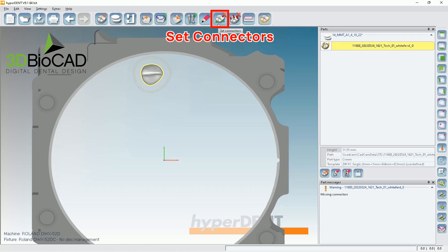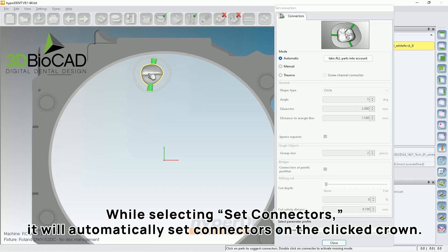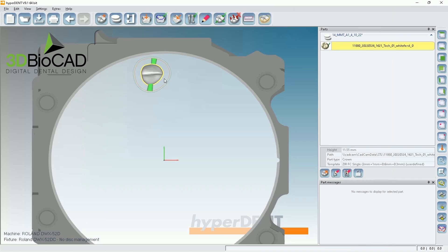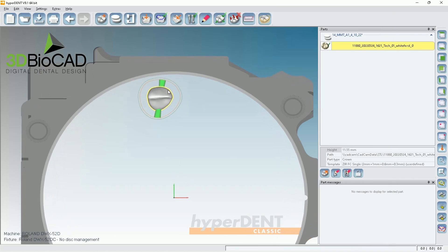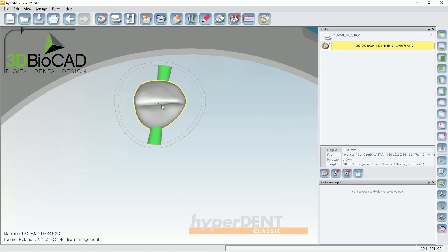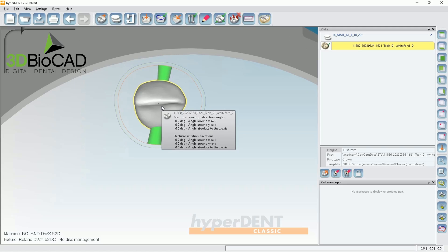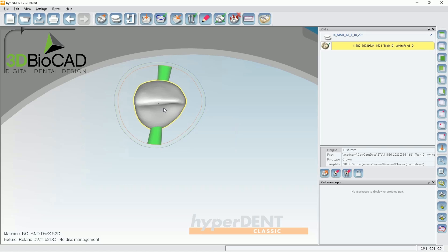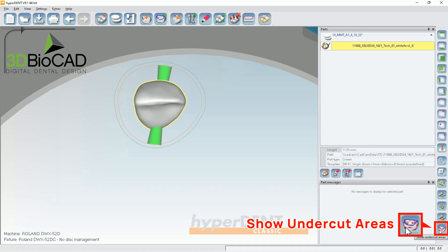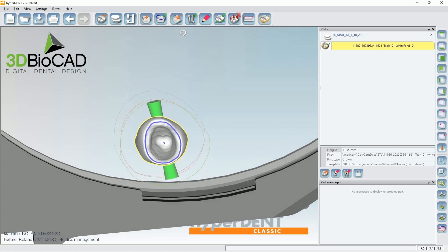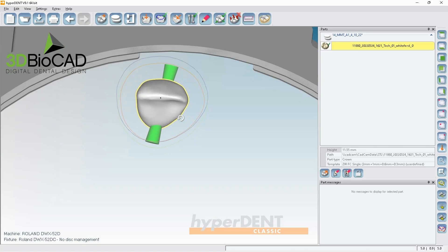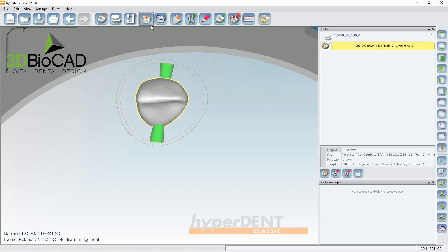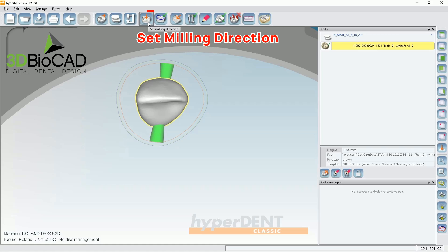And go to connector. Set connectors. And click on it. Then the software will try to add sprue or connectors on the best area where it thinks it'll have the least undercut areas. A lot of people ask me for anterior cases, there could be some undercuts on the lingual side because when they design, they try to have the cusp a little bit curved. So for those cases, if you look at the bottom right, there is show undercut areas. If you enable that, then the system will try to bring the undercuts. But in this case, it doesn't have much undercut, but let me show you something.